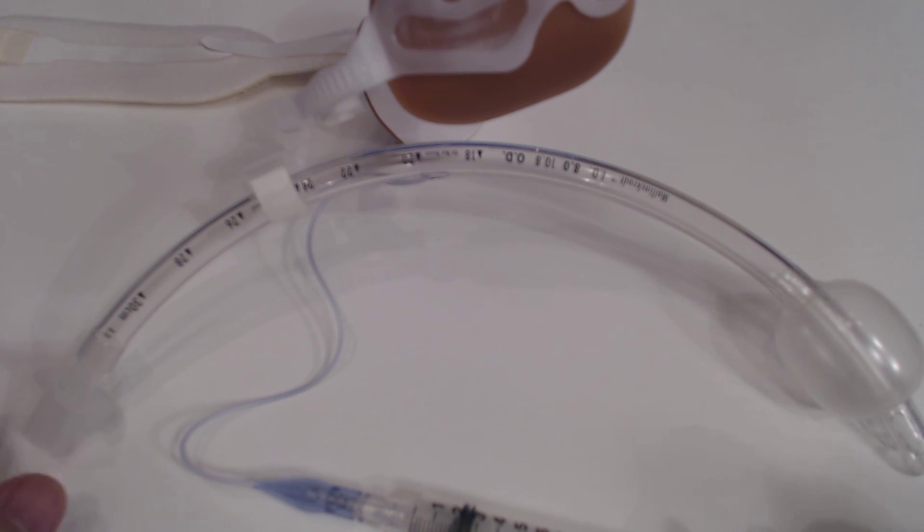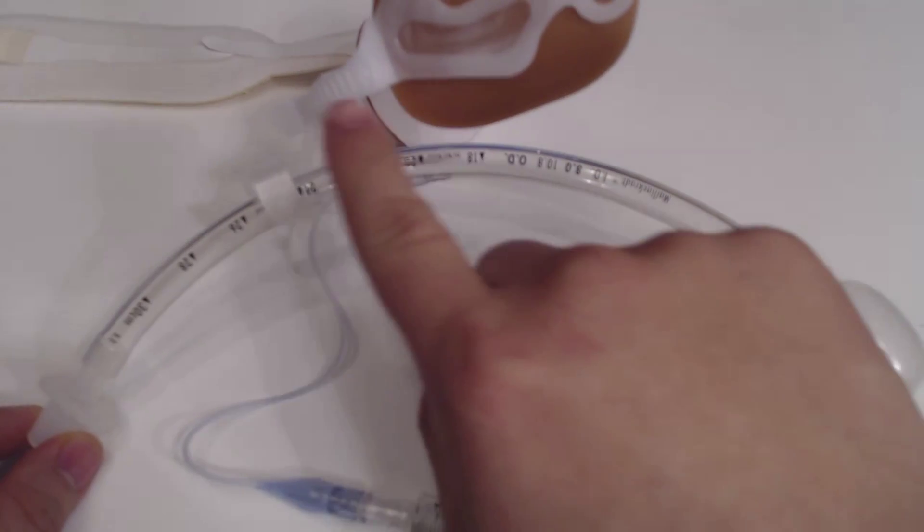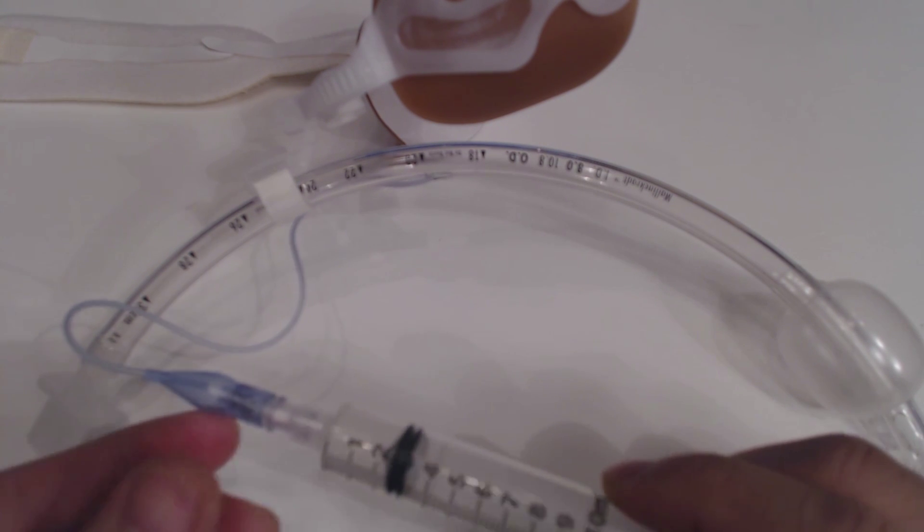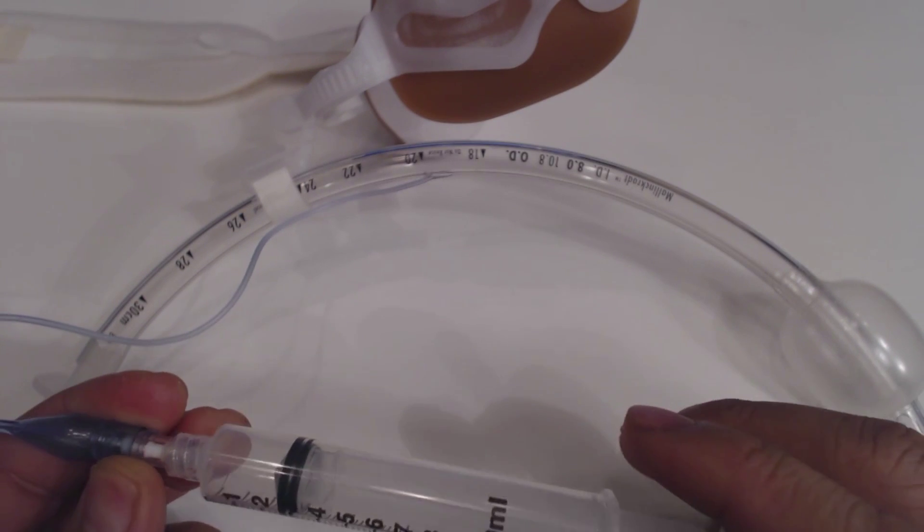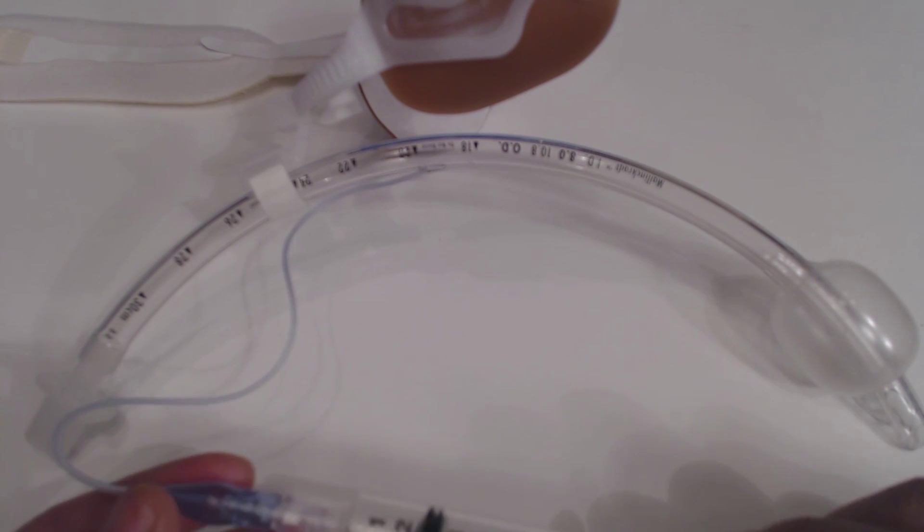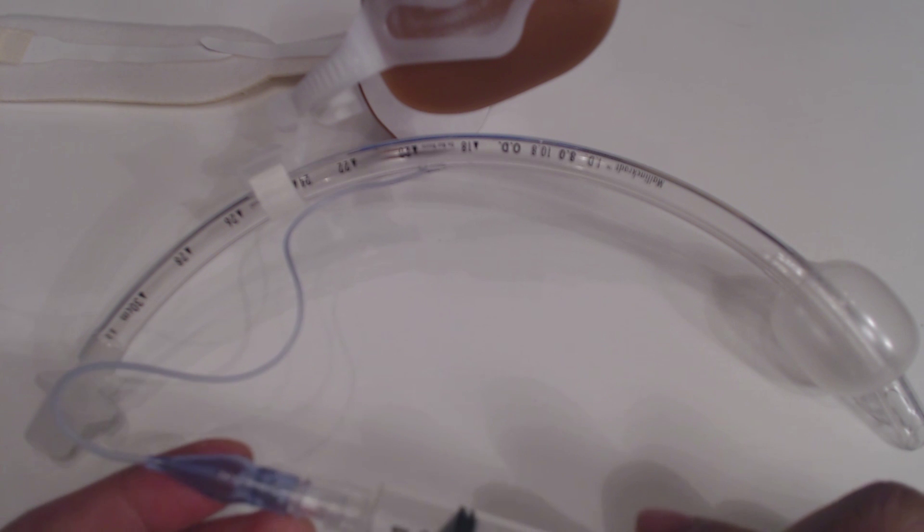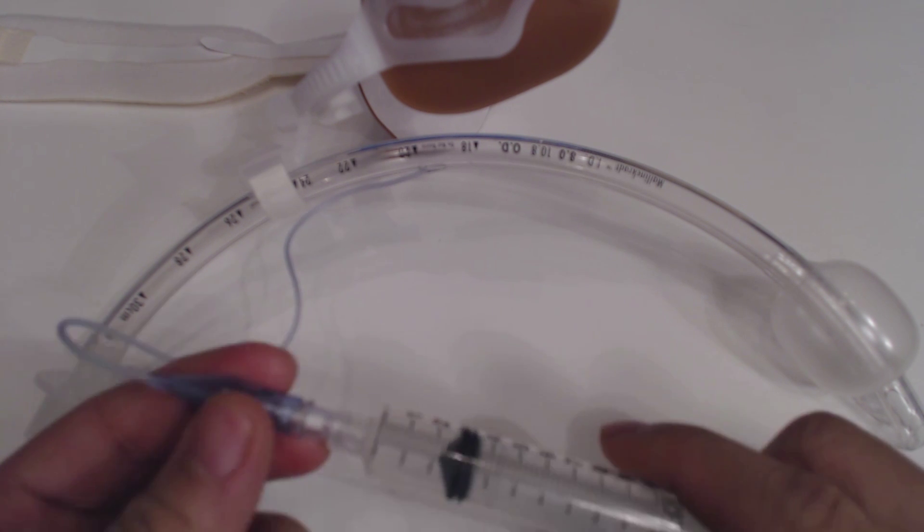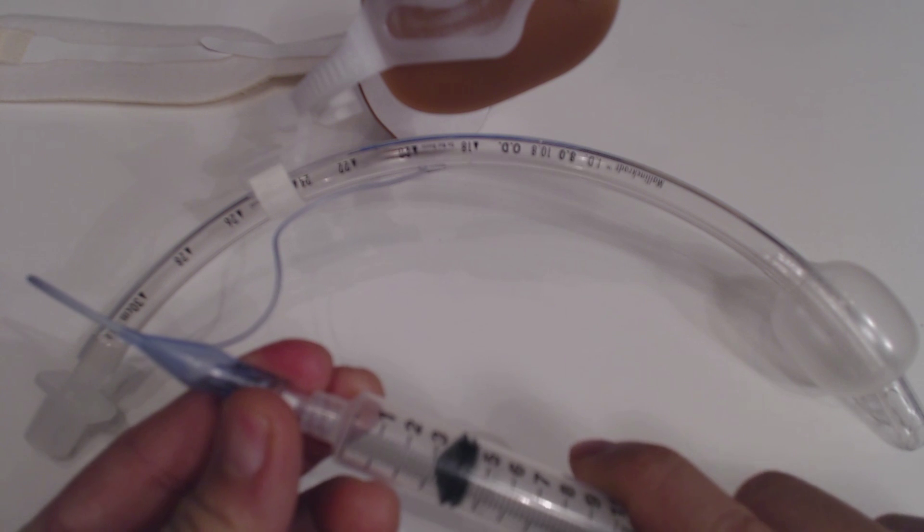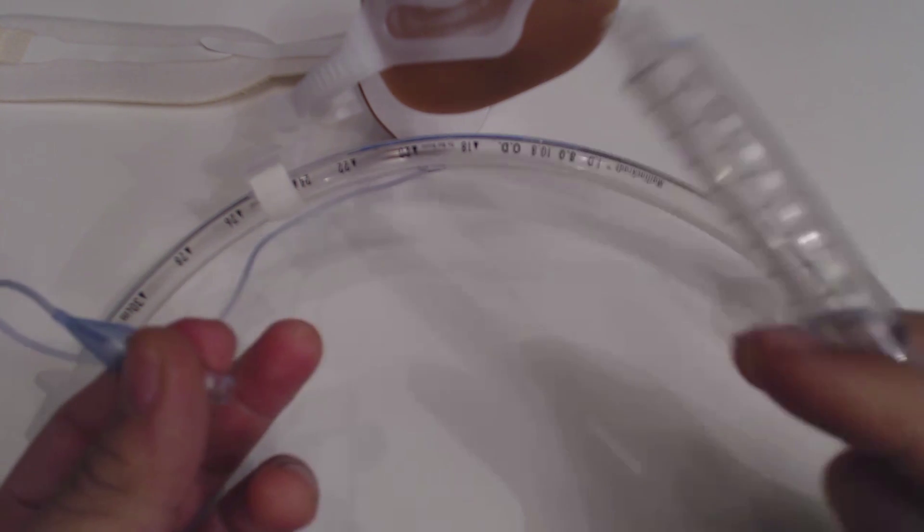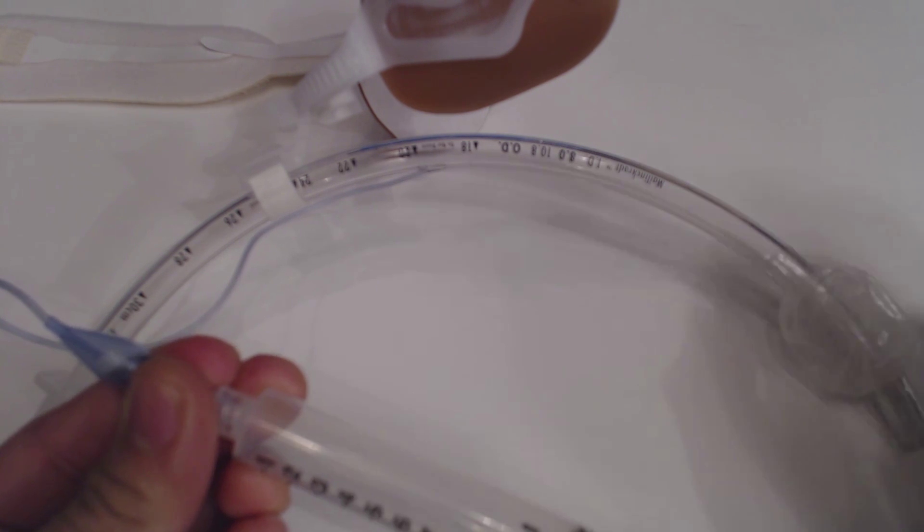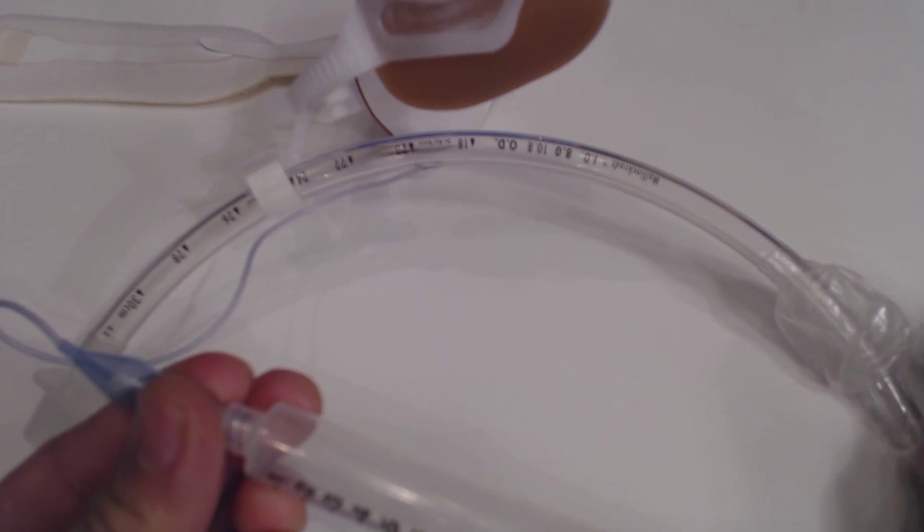Once again, the different parts of the endotracheal tube, we have the standard 15 millimeter connector on the tube itself. Here's the endotracheal tube holder. We also have the pilot balloon. And this is where we will either instill atmospheric air or take it out so that we can deflate the endotracheal tube cuff here. So once again, when we are checking for a positive air leak, so that's one of the last things we're going to do. We're just going to take a standard 10 cc syringe, attach it to the pilot balloon, and we will take all the air out. And we'll do it all the way until we hear the patient gurgling. And as you can see, the endotracheal tube cuff here is deflated.